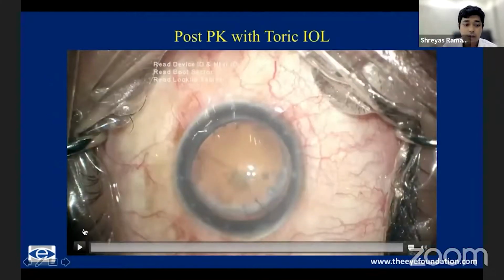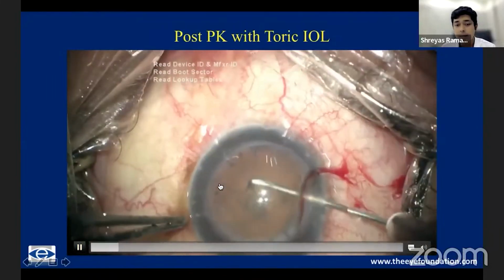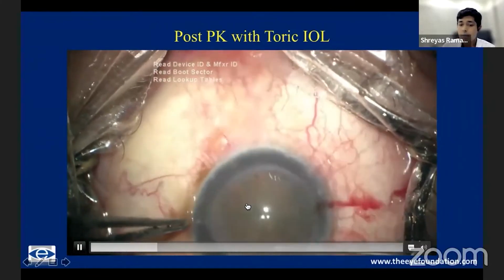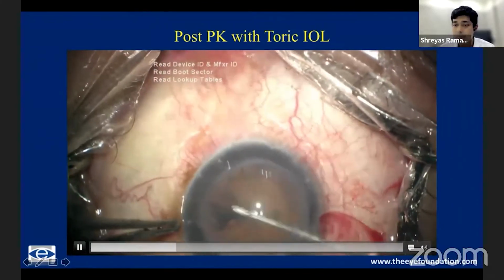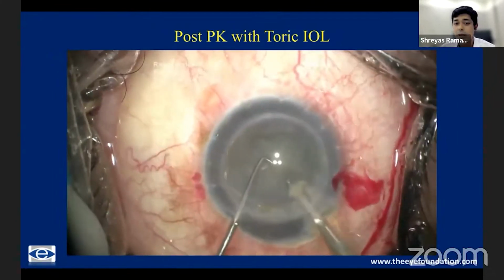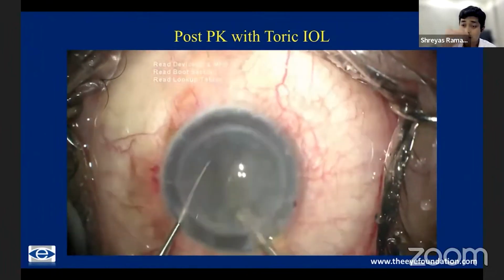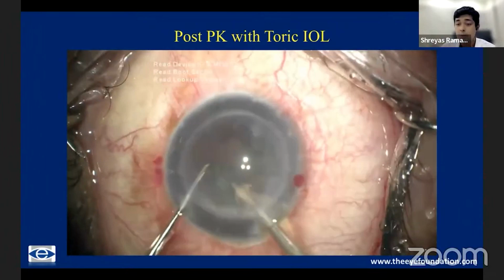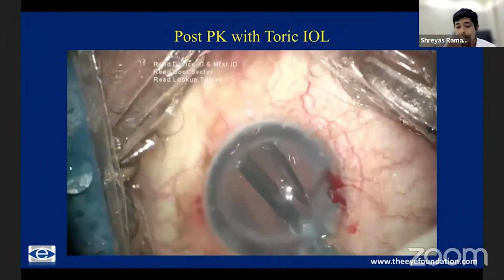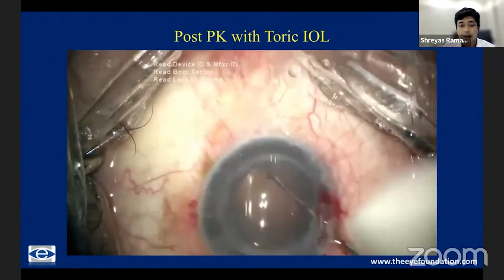And let's say for this example, this patient for the last 1 year had a stable astigmatism, had 4 to 5 sutures already left in situ, but these sutures were not becoming loose, were not going to disintegrate in the time period, but had developed a steroid-induced cataract. So in these patients, if you remove some of those sutures which are in the opposite axis, you might actually end up increasing the amount of astigmatism. And therefore, it is just better to leave them aside and go ahead with the cataract surgery itself.